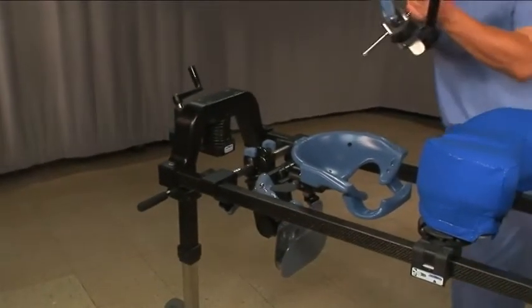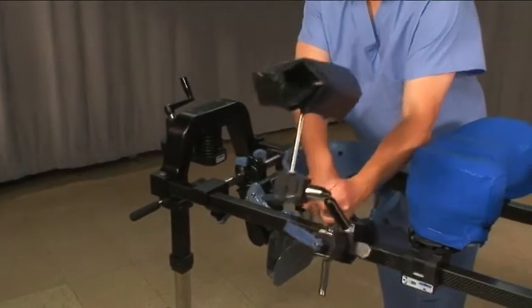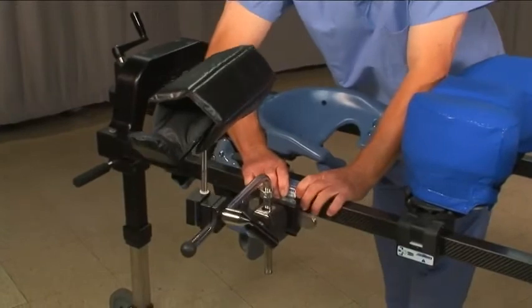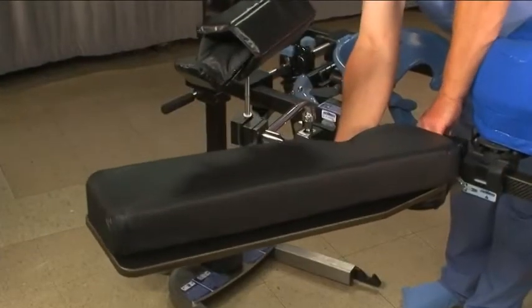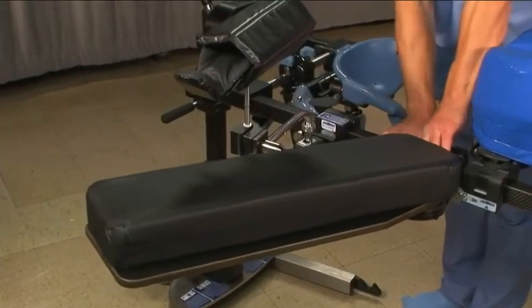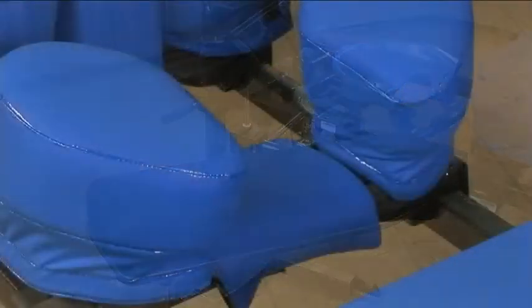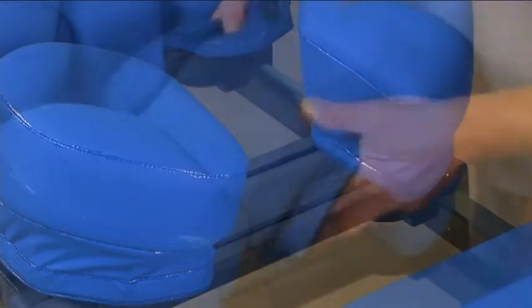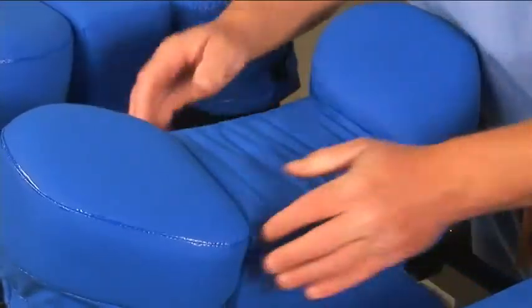The recommended products for lateral procedures include the C-Flex and the wing set system, one prone arm board, and one standard arm board. To better cushion the patient's hip, replace the flat center pad from the hip wing set with the wing set lateral hip pad.